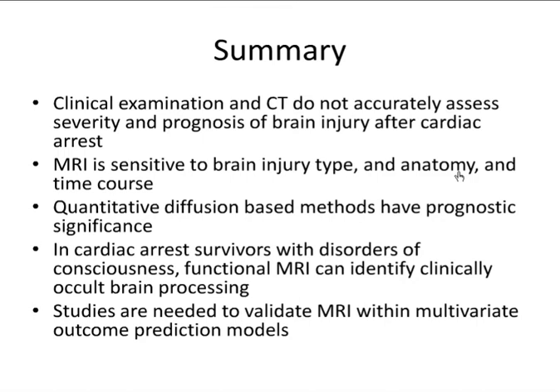Of course, we need many, many more studies, and some of these are ongoing within my group, to understand the relevance of MRI, both structural and functional, in predicting outcomes after cardiac arrest.